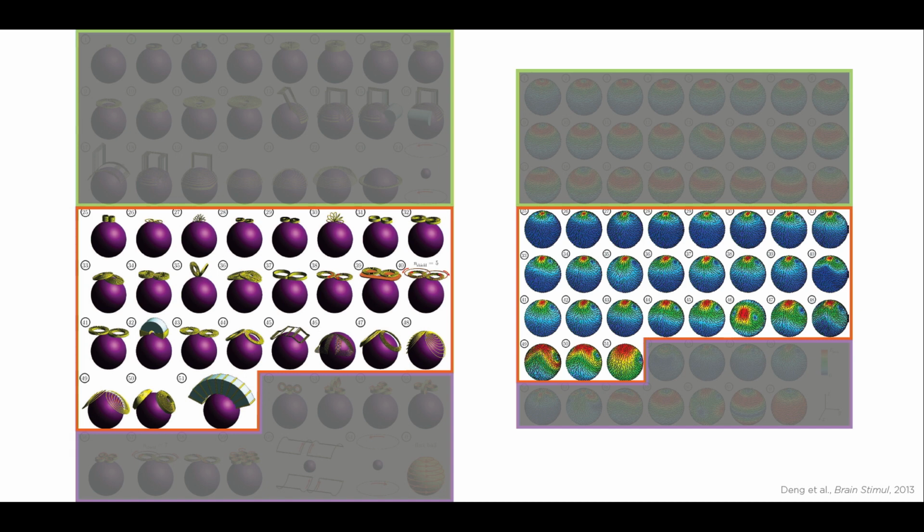Some of the coils that were used to stimulate deeper in the brain include magnetic seizure therapy coils, illustrated in coil number 50, and also the double cone coil, sometimes used to stimulate the leg area, which is slightly deeper than the hand motor representation on the cortex, and that is illustrated in coil number 47. And so you can see here, compared to the circular type coils, the electric field produced by figure-8 type coils is generally more focal.